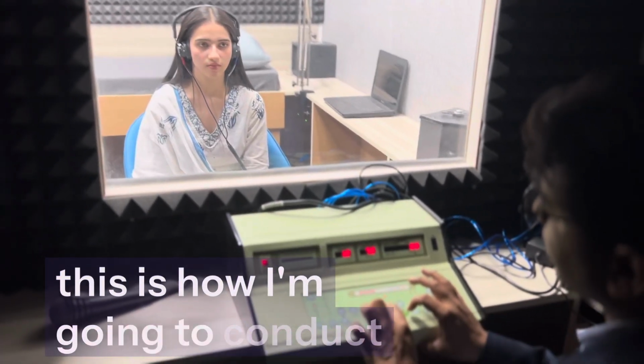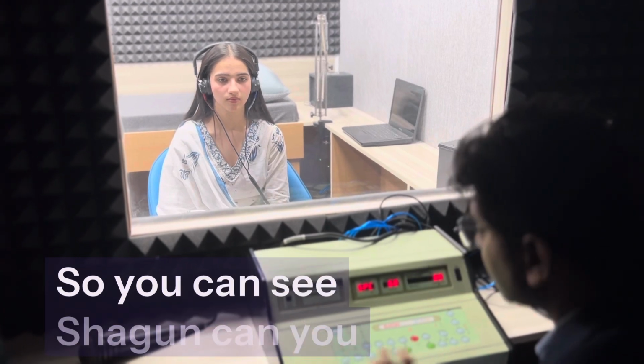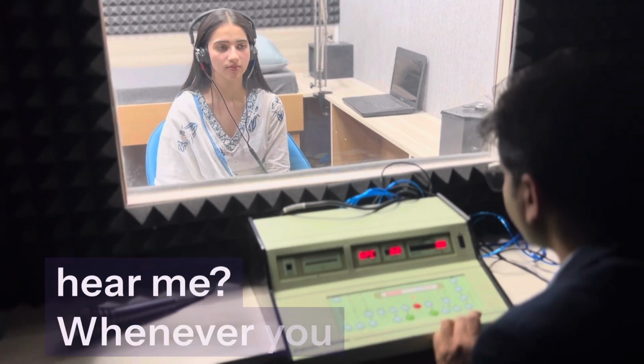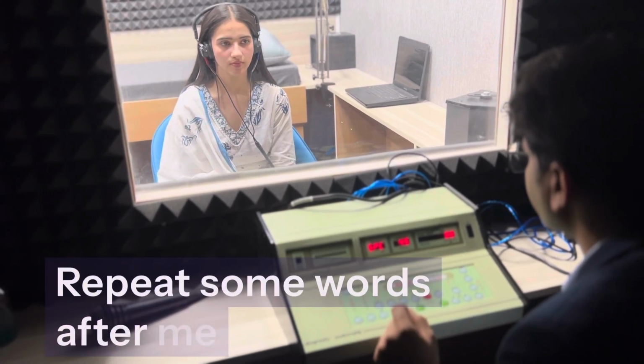And this is how I'm going to conduct the audiometry. After this, I will be conducting the speech audiometry. So you can see, Shagun, can you hear me? Whenever you hear, just raise your hand or press the button. Can you still hear me? Repeat some words after me.